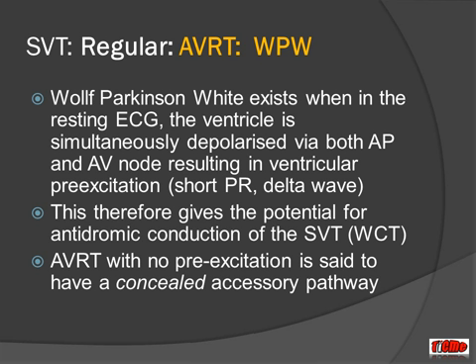Okay, so let's talk about AVRT and Wolff-Parkinson-White. Wolff-Parkinson-White syndrome exists when in the resting ECG the ventricle is simultaneously depolarized via both the accessory pathway and the AV node, causing ventricular pre-excitation.